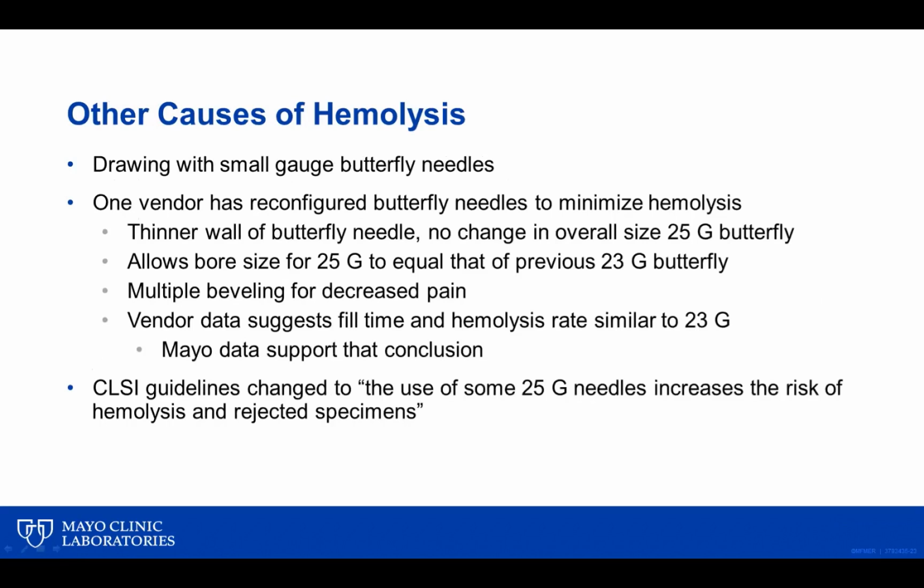So, other causes of hemolysis. We've talked about some of the major interventions we implemented to reduce our hemolysis rate in the ED and NICU, but there are others that some of the submitted questions wanted to hear about. Historically, data suggests that collecting with small gauge butterfly needles increases hemolysis. This is actually a very controversial area right now. One of the vendors has reconfigured their butterfly needles with the goal of minimizing hemolysis.